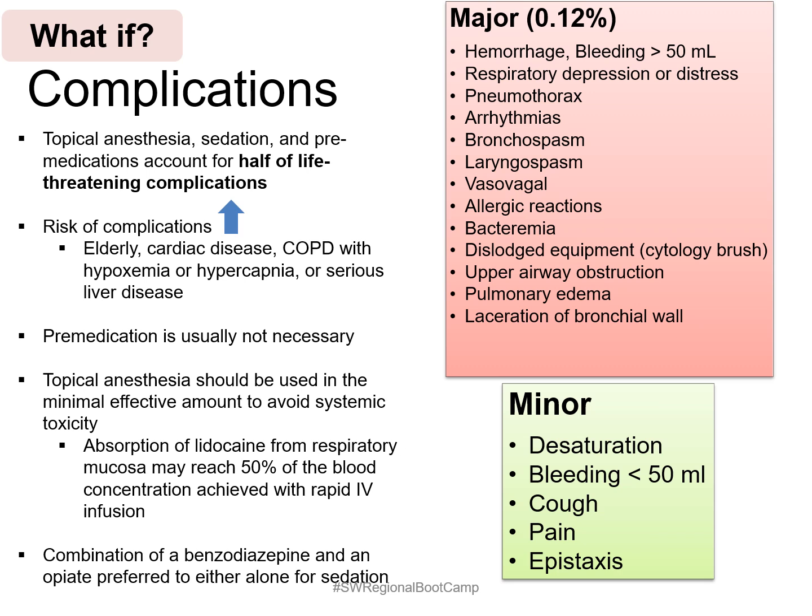In general, pre-medication prior to sedation is not usually necessary. Sedation is provided with benzodiazepines and opiates, and a combination of the two is preferred to either alone. Please also note that topical anesthesia itself can cause complications, and therefore it should be limited to the minimal effective amount to avoid systemic toxicity.